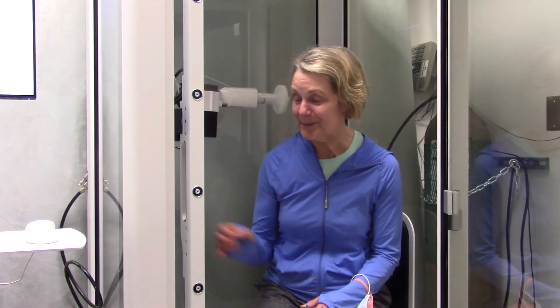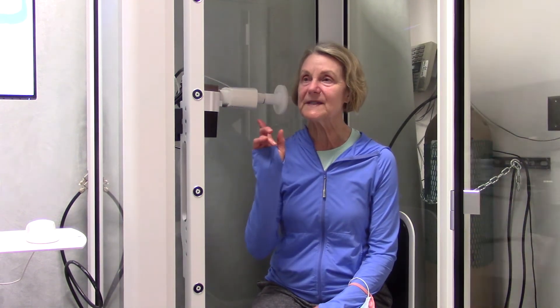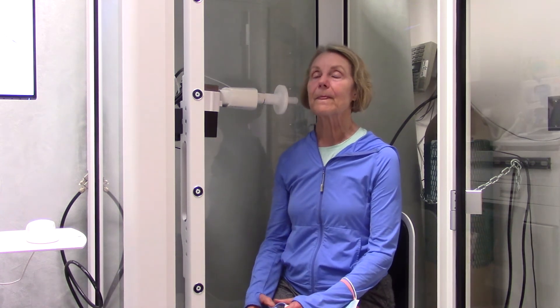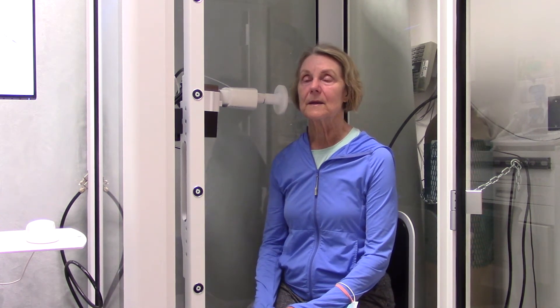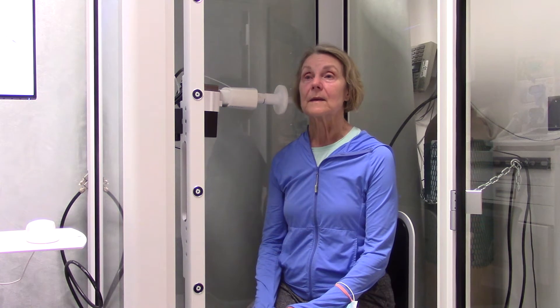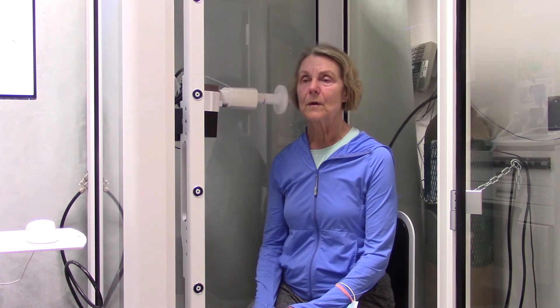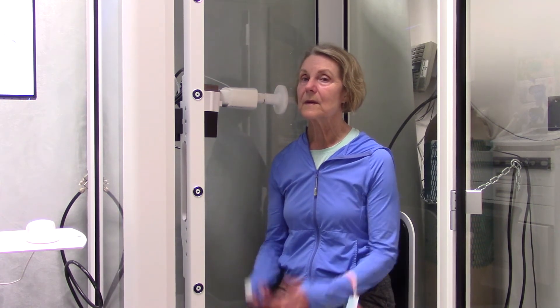I actually have a little button to push which is neat. Now can you explain what the purpose of that last test was? So the last test we will measure the patient's total lung capacity. We will measure all the volume from the upper to the lower airway.